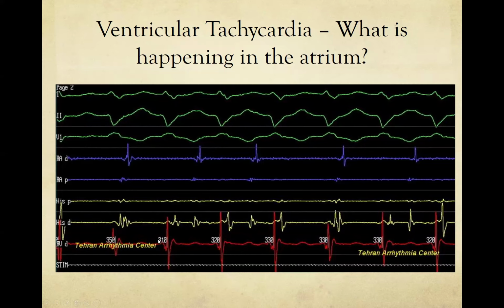That's because the catheter is probably sitting in the RV apex, so the ventricle is actually depolarizing before the impulse ever reaches the tip of the catheter. It might be that you randomly and luckily get the catheter in the RV at exactly the earliest point, but anyways, that's a minor point. But you're correct. I'll just look at the high right atrium for simplicity. Here's the V, and then here's a retrograde A, and here's a V and a retrograde A.